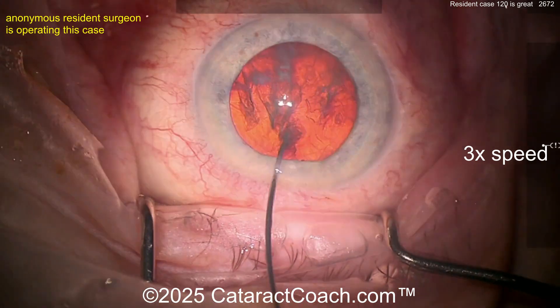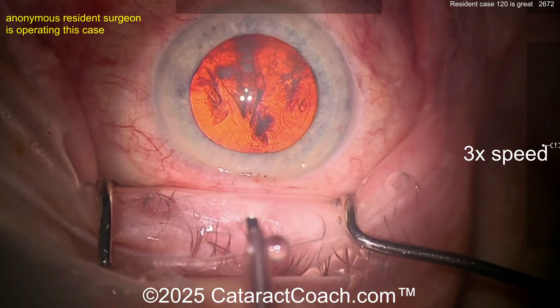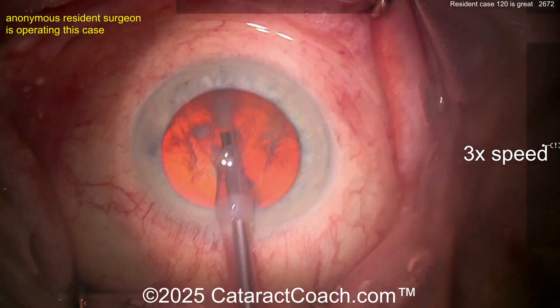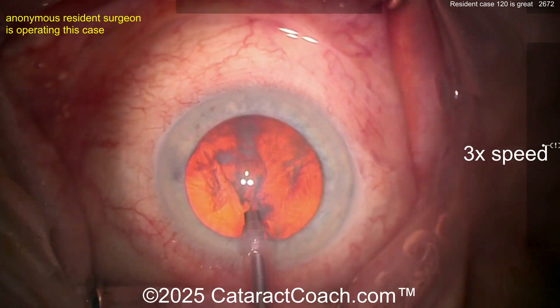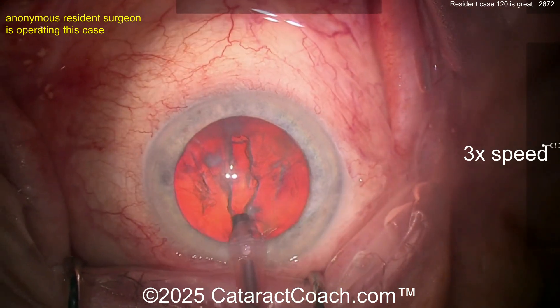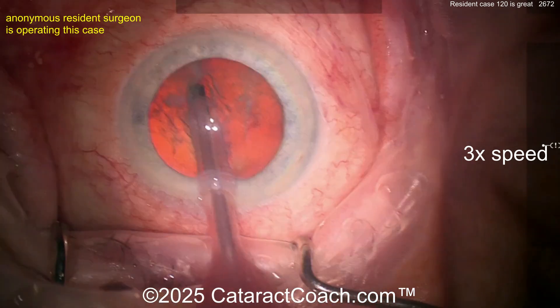A little bit more hydrodissection, and let's see if it rotates. Remember: if it does not spin, you will not win. Maybe it rotated a little bit — we'll find out. Here comes the phaco probe going inside the eye. Looks like the smaller sleeve — the pink sleeves are 2.2, maybe 2.4, somewhere in that range.